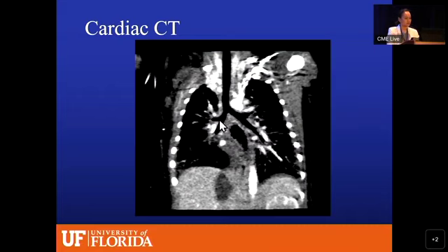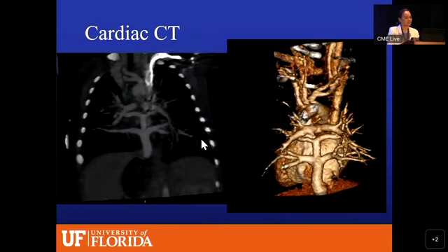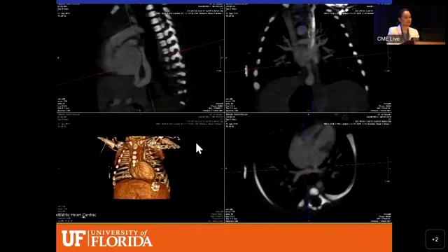And you can see here there's bilateral trilobed lungs or bronchi, and this is right atrial isomerism. This is just a good picture of that, the same patient with infradiaphragmatic total anomalous venous return with this Christmas tree-ish pattern here going down the vertical vein draining to your IVC.